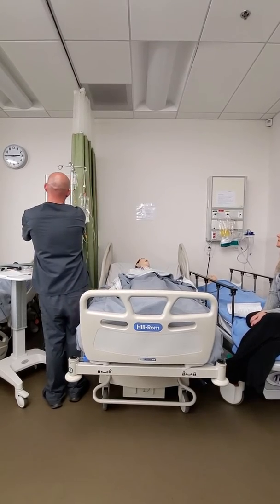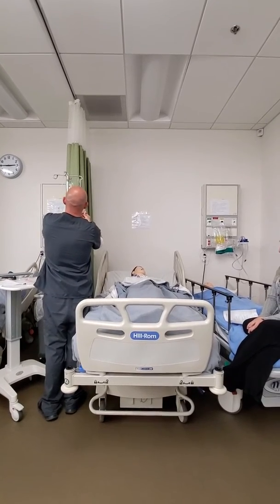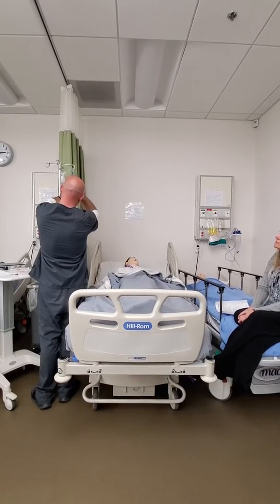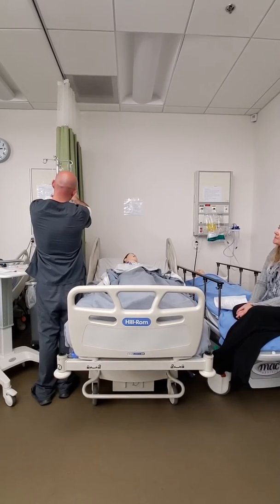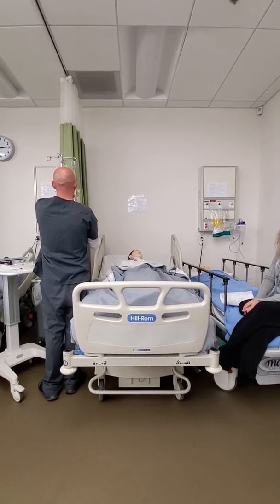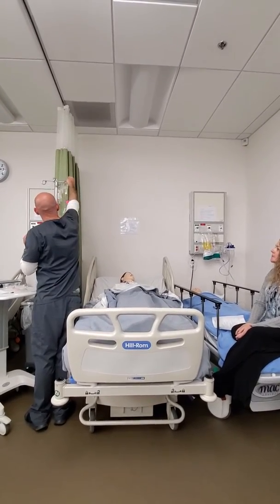This one's gonna come through here, so I want this locked. I need practice. And I wanna check the time that this tubing was used, because it's good for, I'd have to look at the hospital protocol. Today it's good for 7 days. Okay, so this previously used tubing is still okay, and I have my primary line locked, and then I can take this back down.